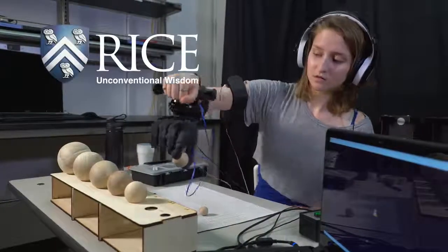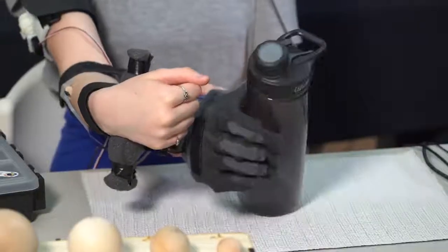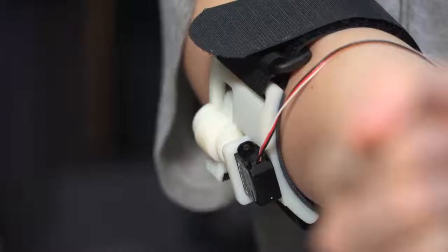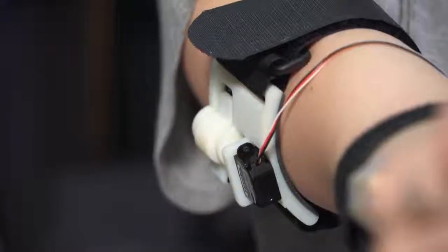For a while in my lab, we've been working on studying the role of haptic feedback for use in dexterous tasks, so tasks that an amputee might want to do with an advanced prosthetic hand. But we've never had the hardware to work with. We've been limited to using simple grippers or virtual environments to replicate that experience. But we've been developing these different kinds of haptic feedback modalities over the past couple of years.